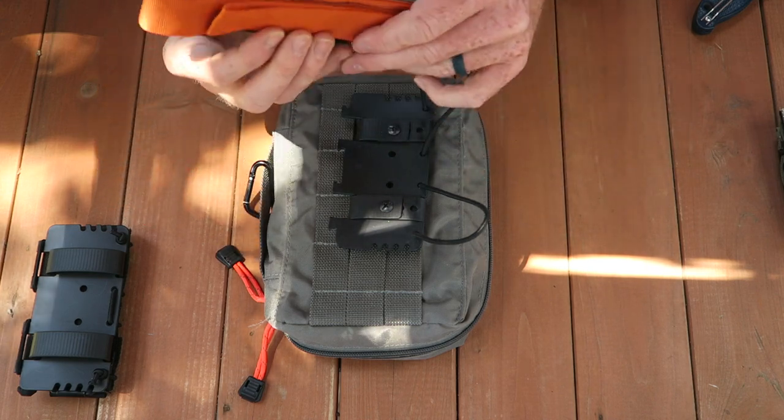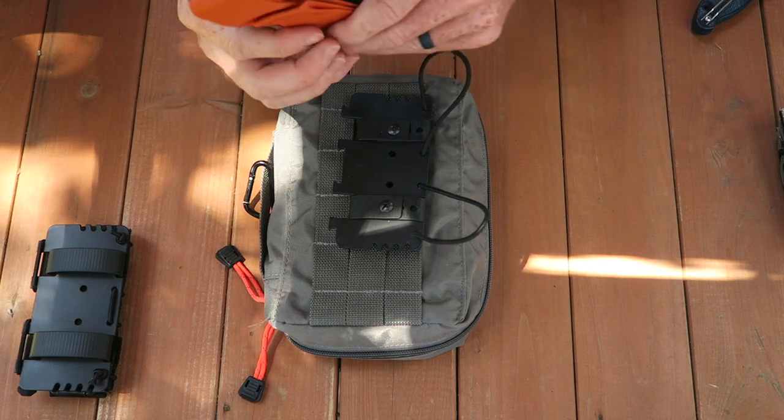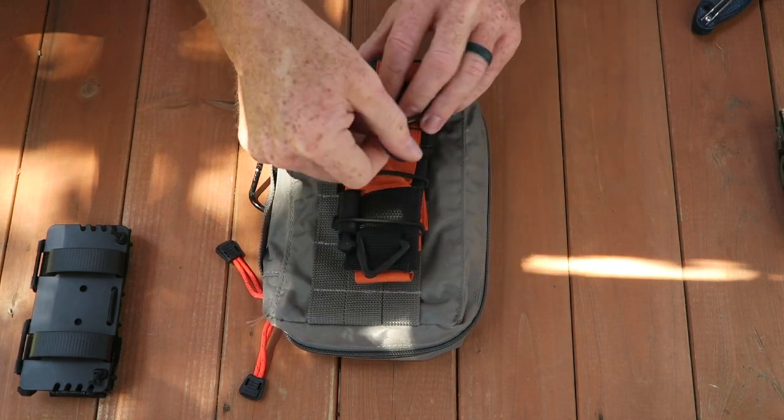I typically use this as my preferred carry method for EDC. I just attach it to my flat pack, run my belt through it, and I'm good to go.